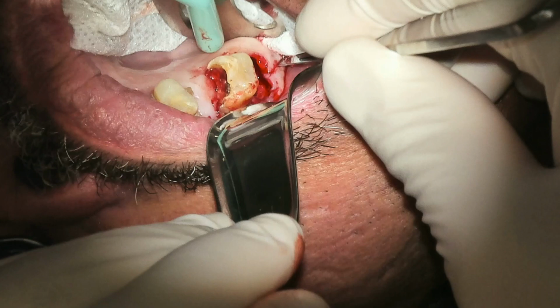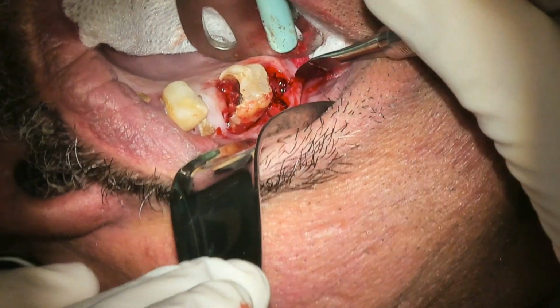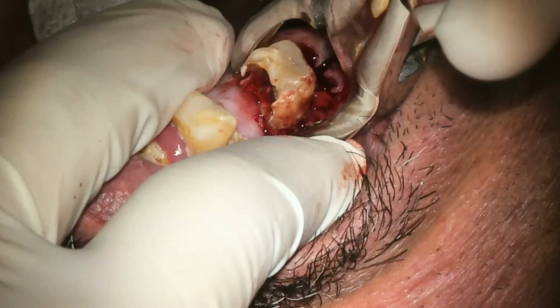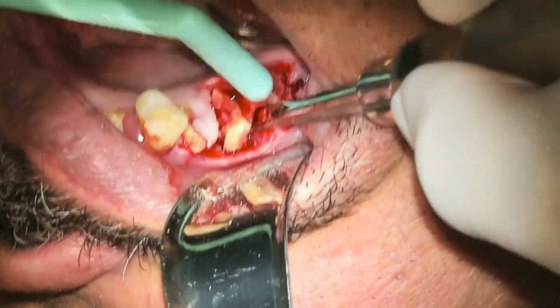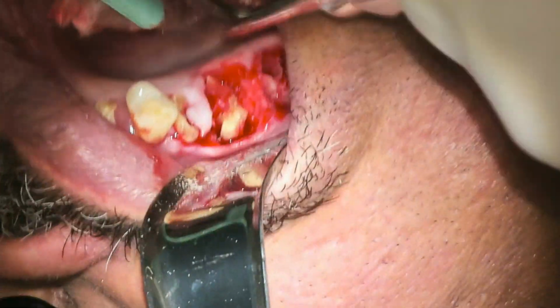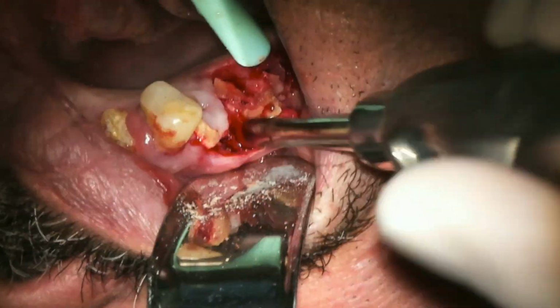Here we go. After that's done, tooth number 3, as you can see with the forceps here, I barely just put the forceps on and the entire thing snaps into my hand. So I actually have to dig for this for a little while, section it, and remove the mesial buccal first, then the palatal, and then I have to fish out the distal buccal root tip. Okay, so that one took a little bit longer than expected.